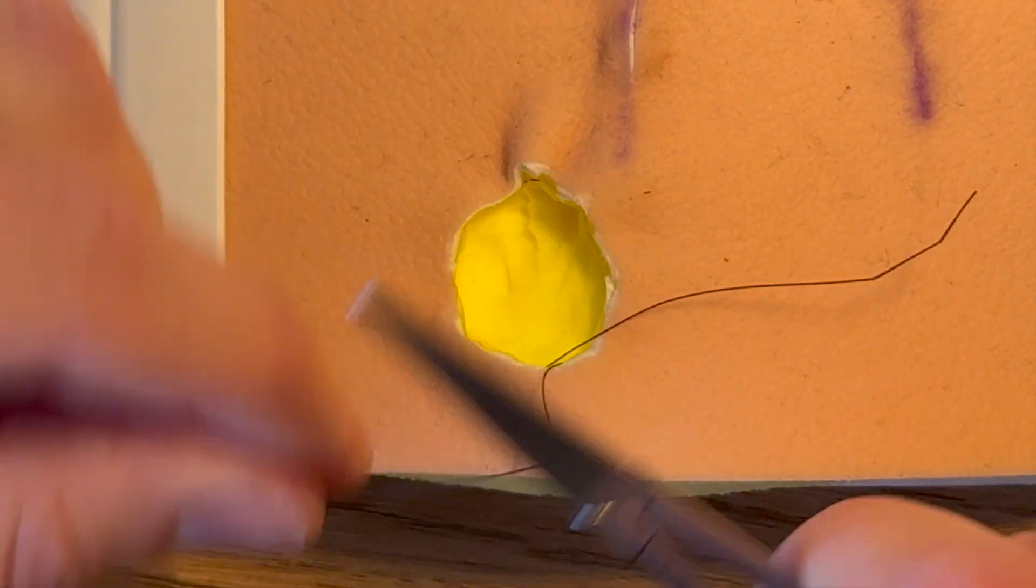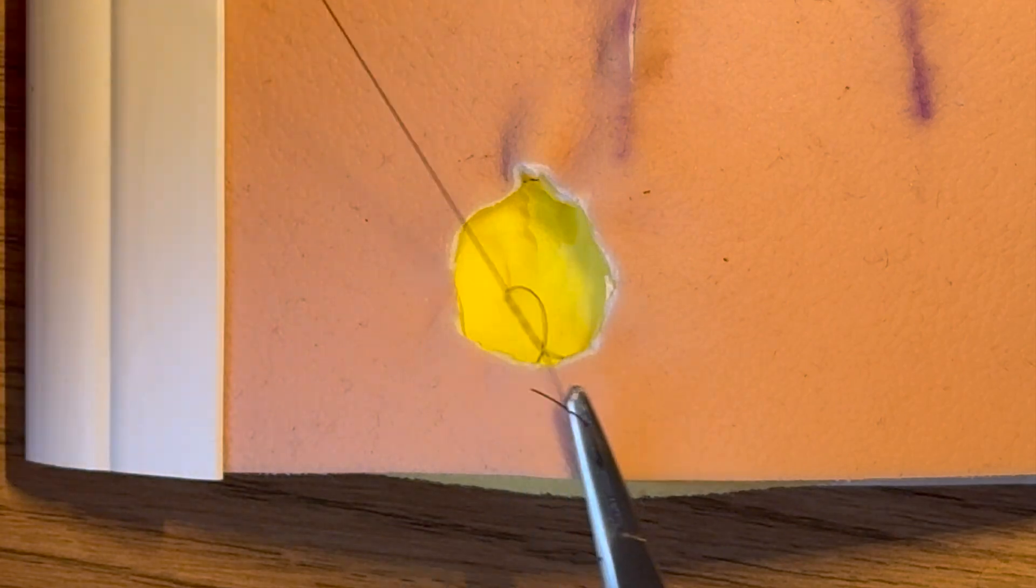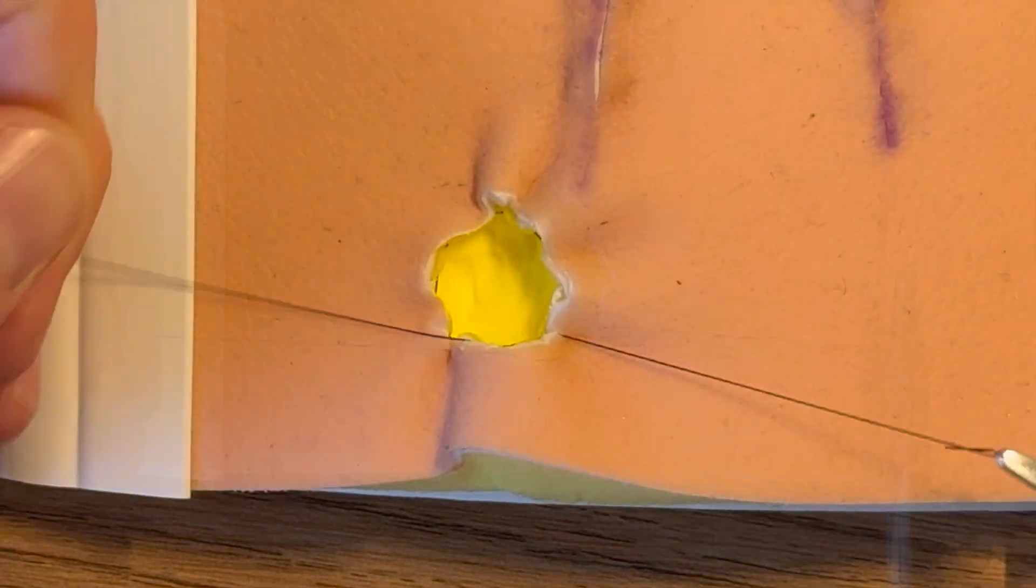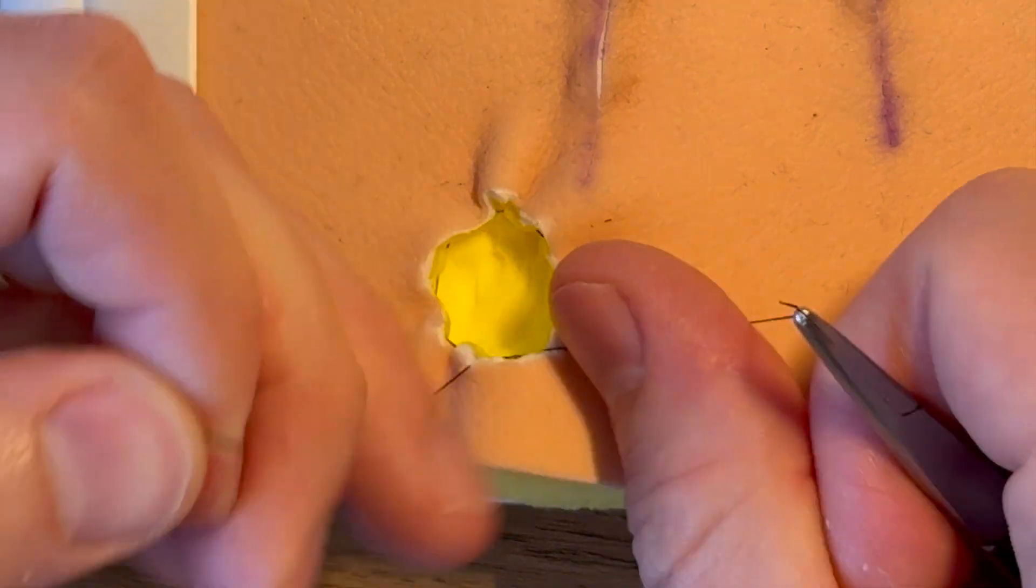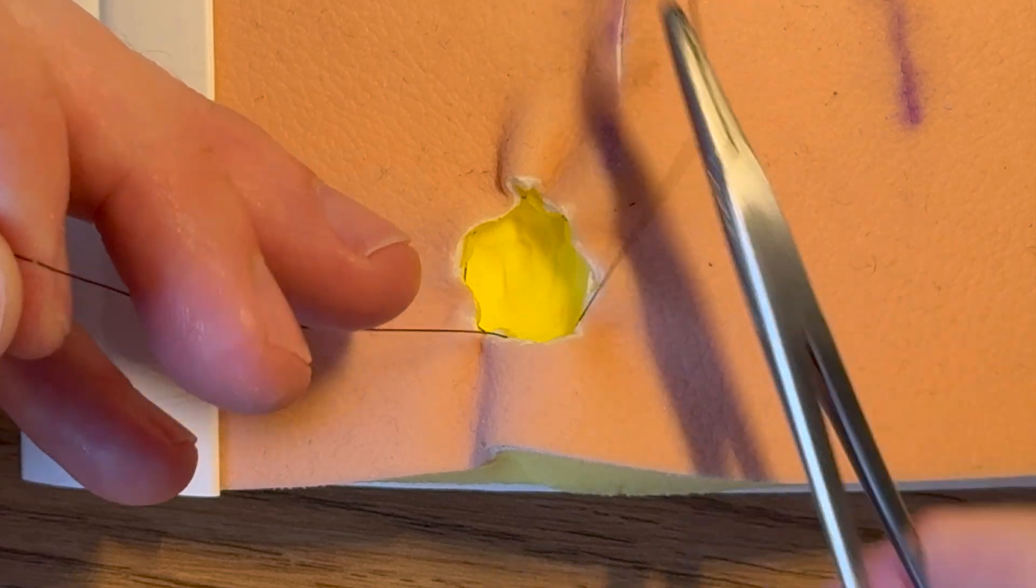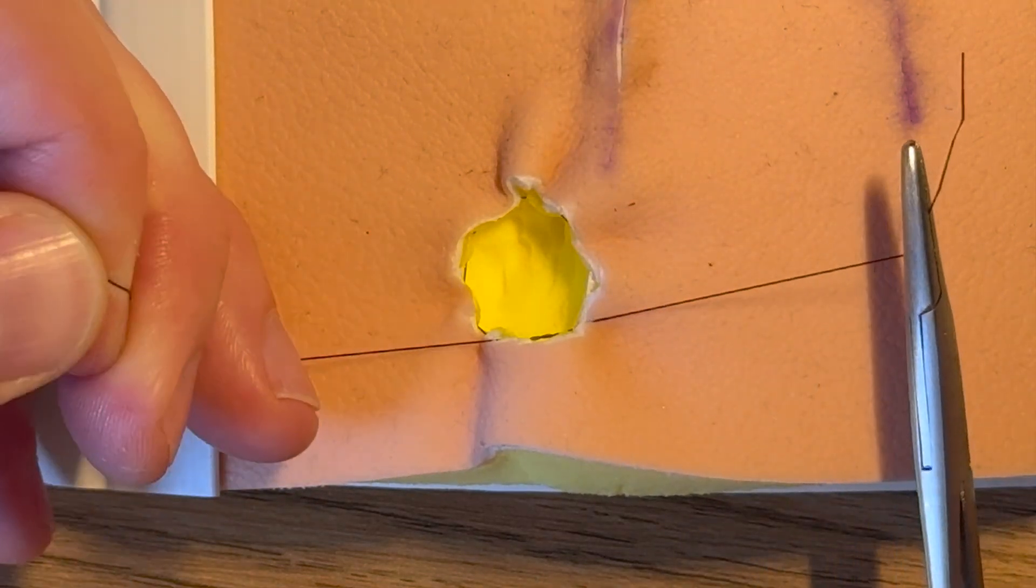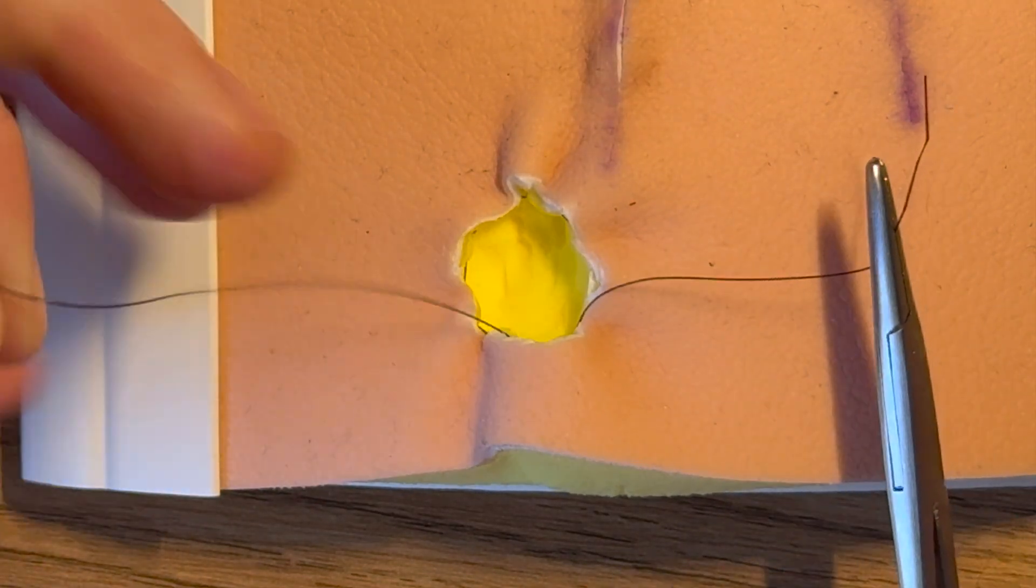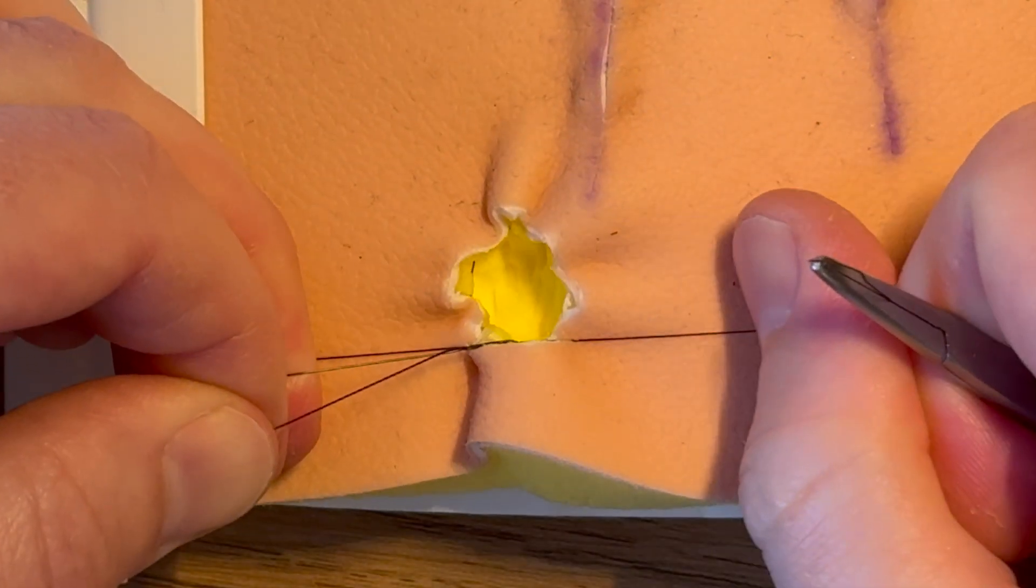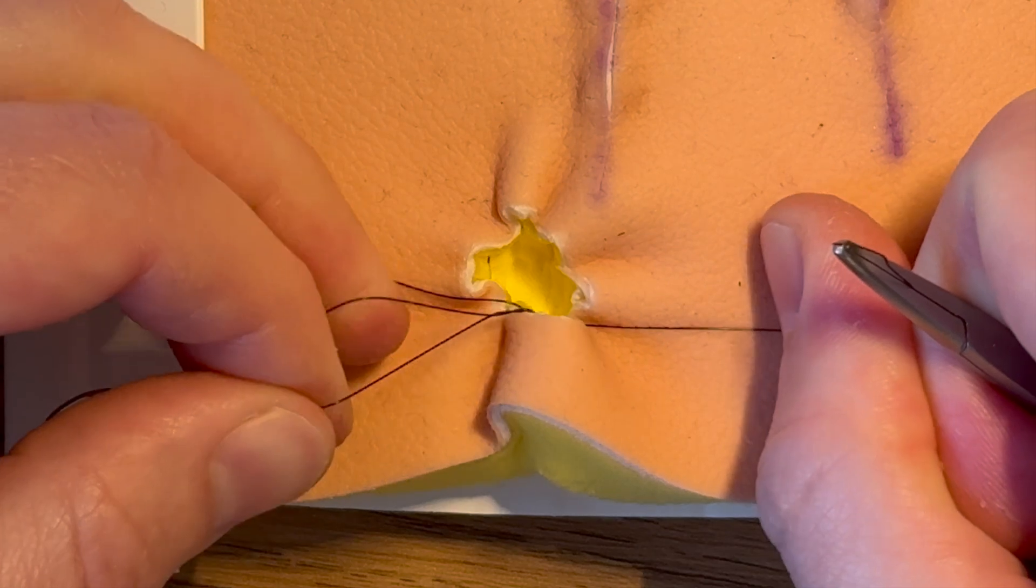And then we need to do our first two throws of our surgeon's knot as we would with anything. Bring that down. At that point you're either going to need an assistant to help you hold it or you're going to need to use some form of tightening slipping knot which I'll cover in another video.